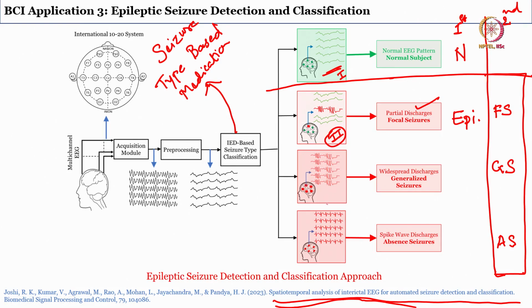Whereas in the third case, you can see this kind of spiky or epileptic behavior in all the channels. The same is being mapped spatially also. It is called generalized seizure, okay, which is spread all over your head. And there are known patterns that generalized seizures are more dominant in the midline. It starts at the midline and spreads bilaterally. Okay. So, there are so many spatio-temporal pictures and topographic analyses you can do.